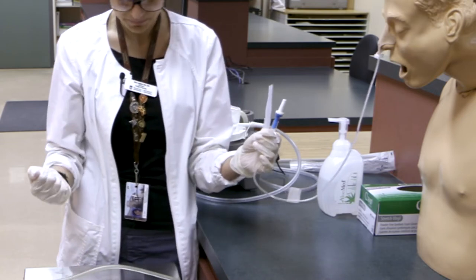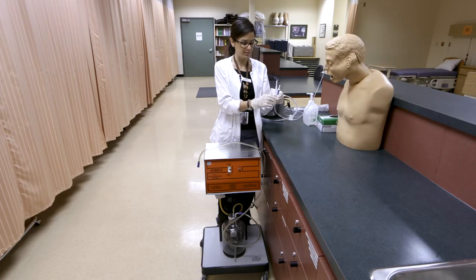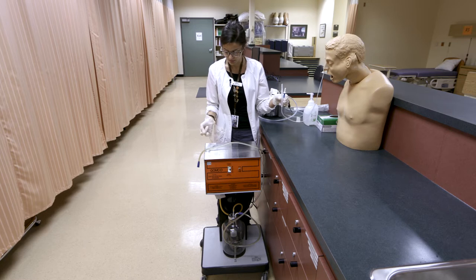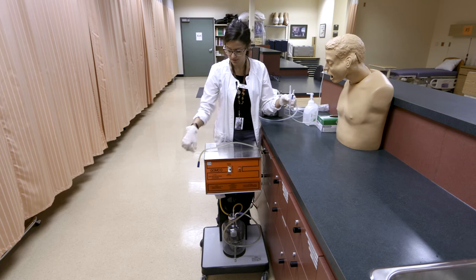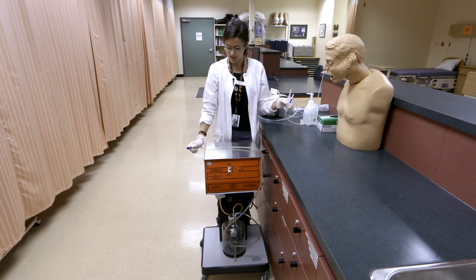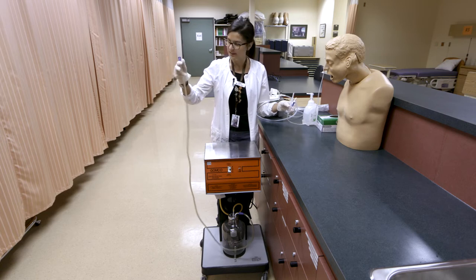We'll insert the connector now — that's what hooks up to our suction. You would need an order for suction. It's typically ordered as low Gomco, and this is the Gomco machine here, the big orange one.